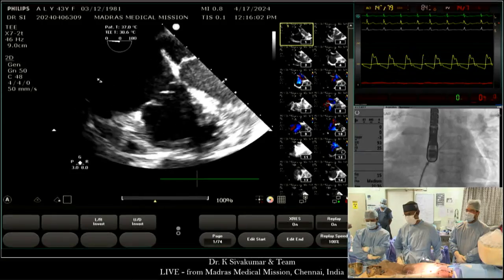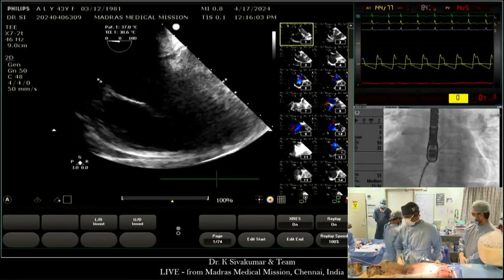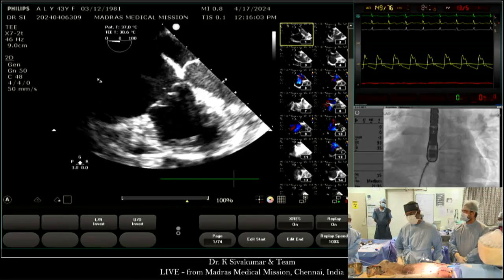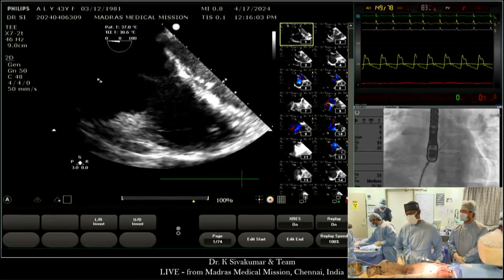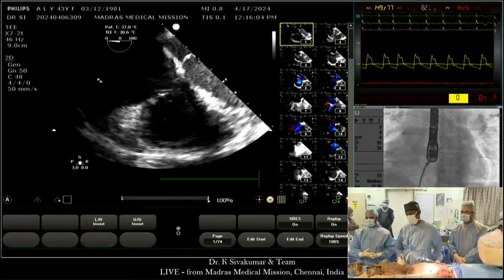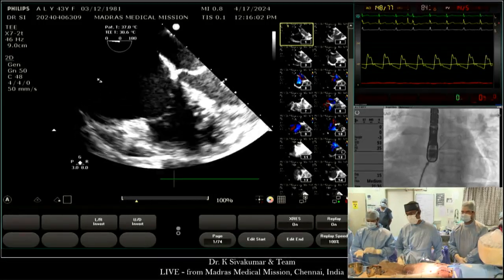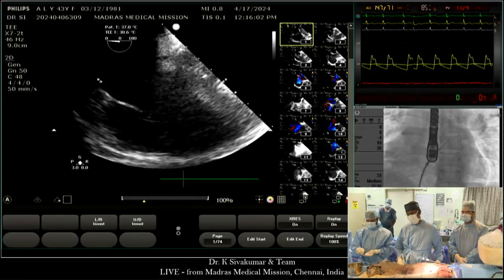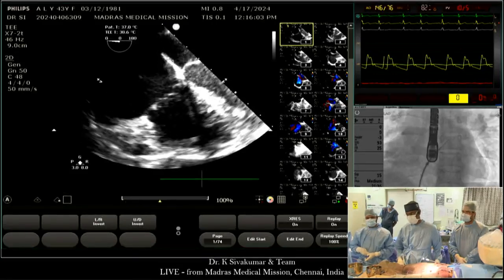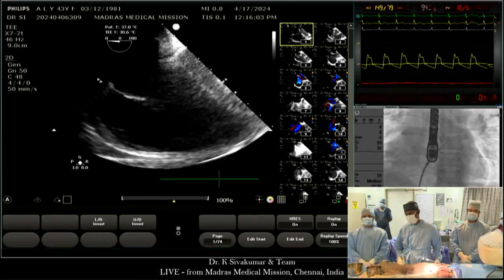Ahmed has questions for the surgeons. Yeah, Zuhair and Ahmed. Is it technically easier? I mean, it's a small and long vein, and to make a connection just inside the superior vena cava. What about the long-term patency of it? Because you will use a graft for this, I think, or saphenous vein. And also, Ahmed asks, is it fair to do it because it is very small?